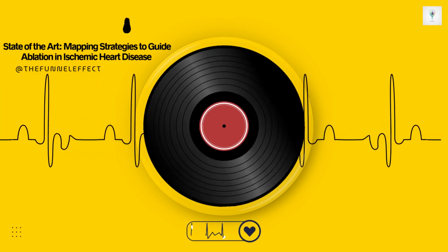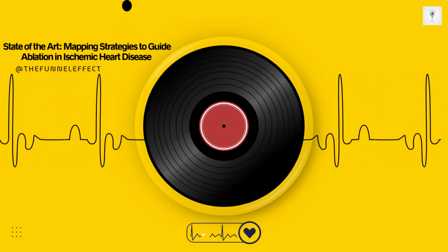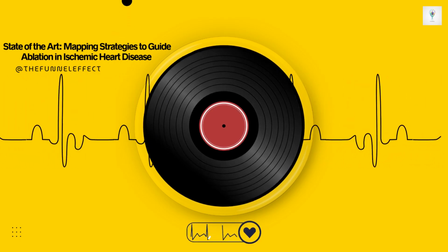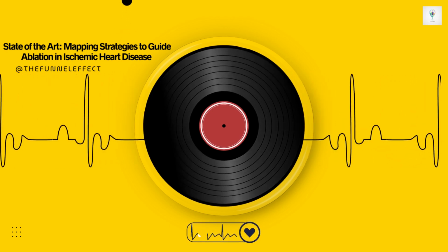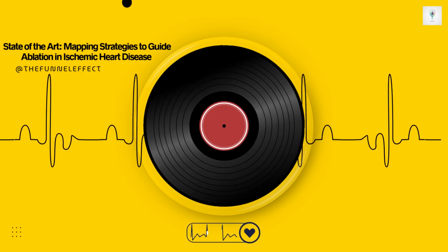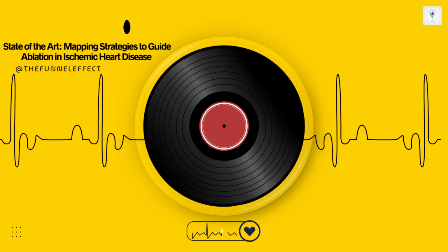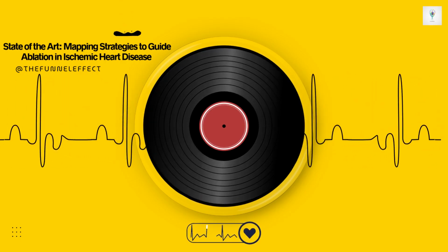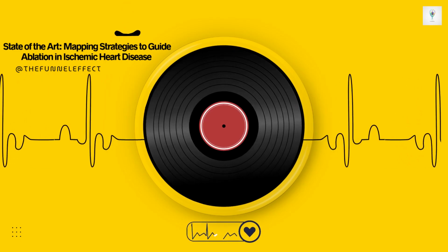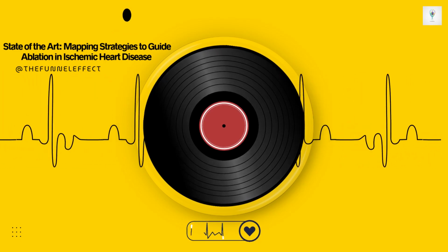And thinking back to that problem of underestimating scar with voltage mapping, is there a functional marker that specifically addresses that? Yes, absolutely. That's hidden slow conduction, HSC. These are essentially EDPs, those functionally revealed delayed potentials, but they're found in areas where the bipolar voltage looks relatively okay, maybe between 1.5 and 2.3 mV. This is precisely that hidden intramural or transmural scar that the surface voltage map missed. Functional mapping forces these hidden channels to declare themselves by showing extreme slowing or delay when stressed.